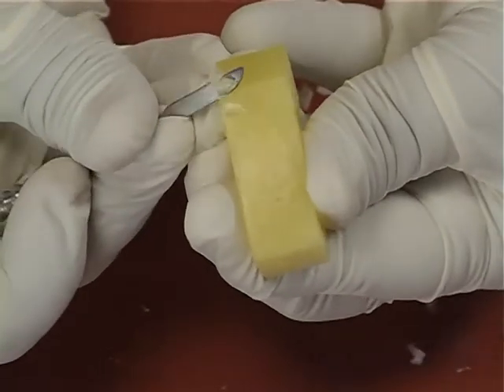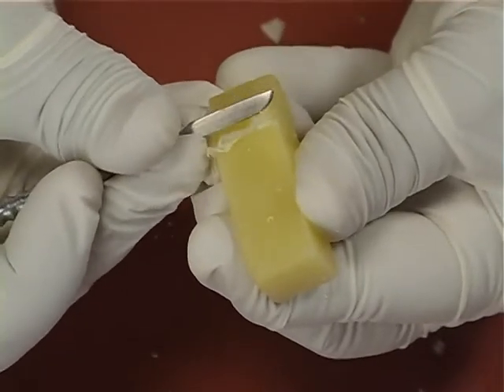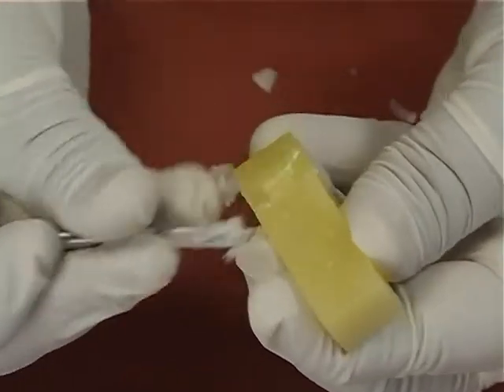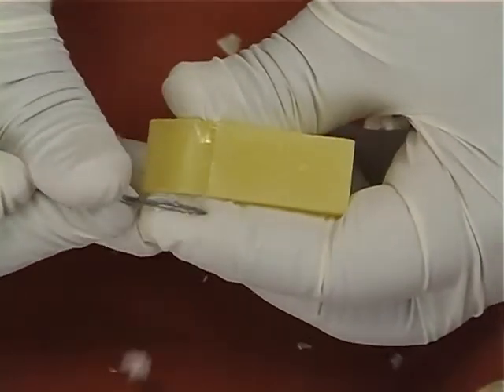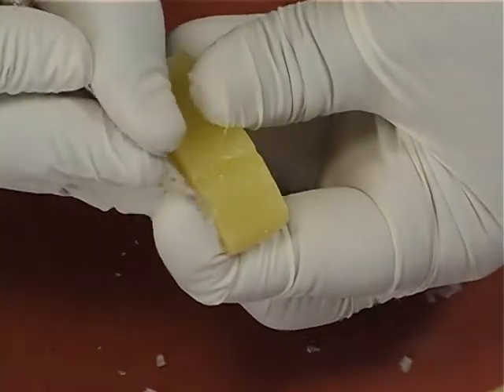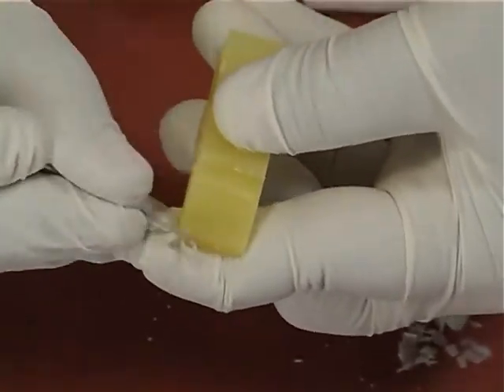Now, by following the palatal outlines drawn on the proximal sides, the palatal convexity in the cervical third is created by removing the wax near the cervical line. This palatal convexity corresponds to the cingulum and should be smoothened and made prominent by deepening the concavity in the middle and the incisal thirds.